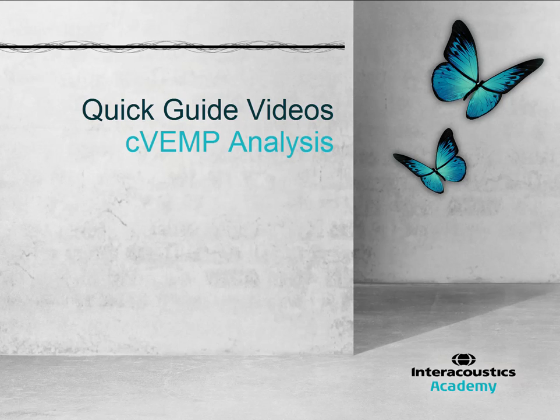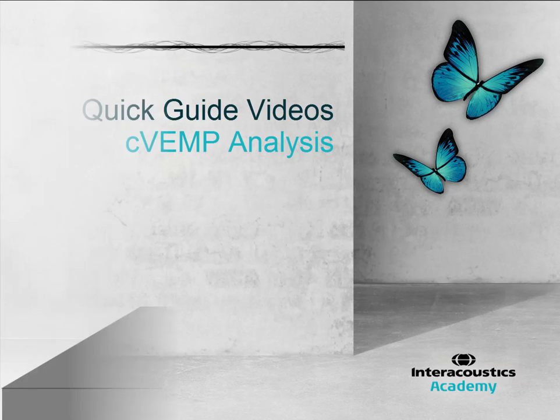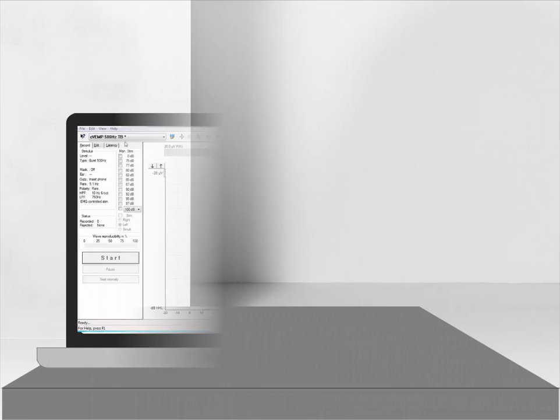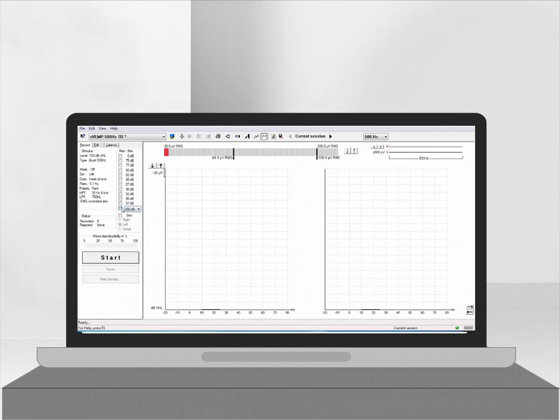This quick guide video provides an overview of how to analyze a C-Vemp recording. Here is an example of a real-life C-Vemp recording.